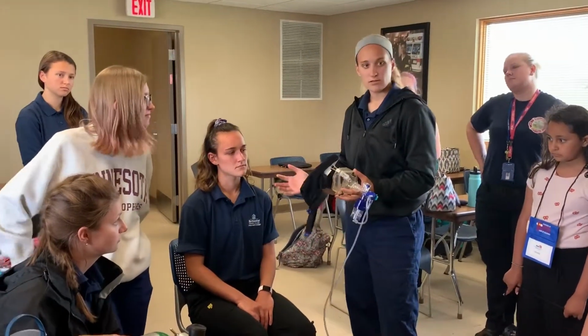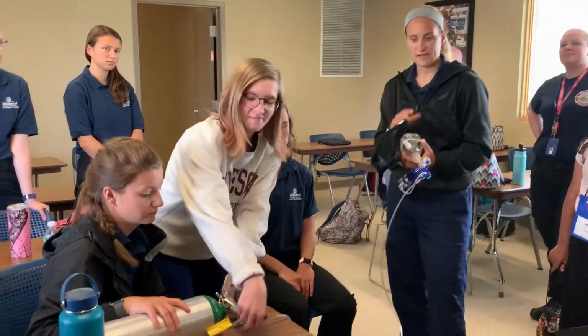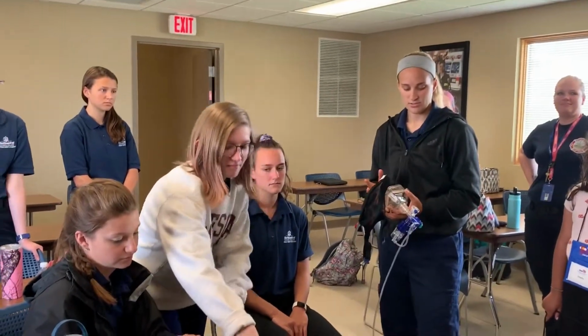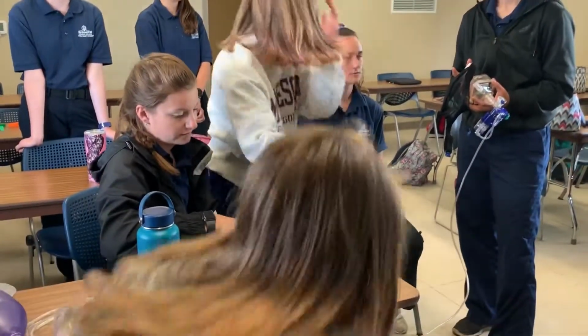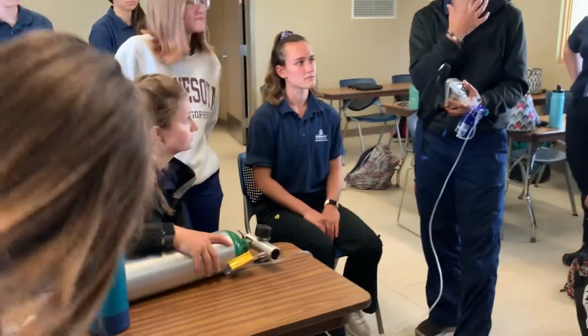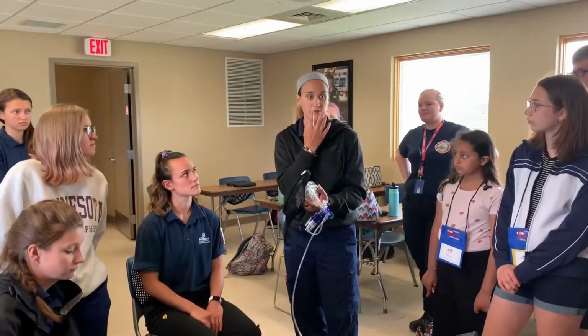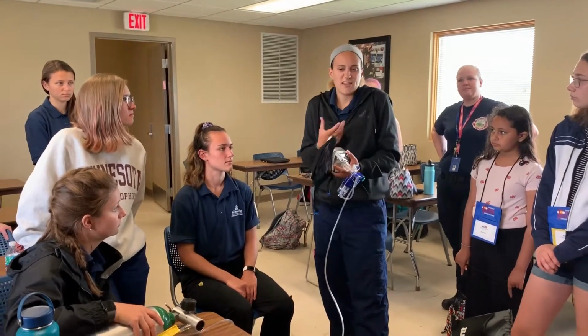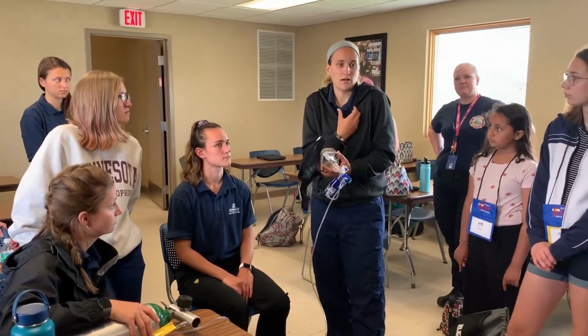When you apply this to their face, it can be very scary. That's what it sounds like, and it can be scary to the patient to have this oxygen blowing in their face, especially little kids. It can give them a claustrophobic feeling.